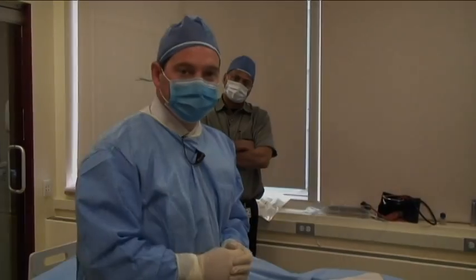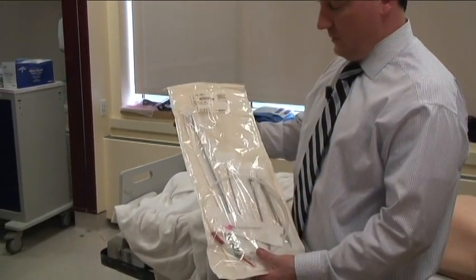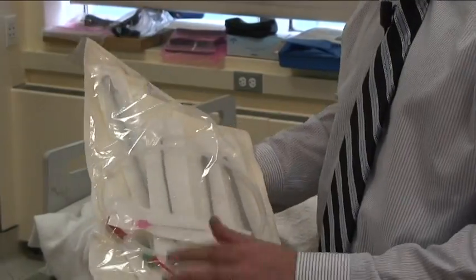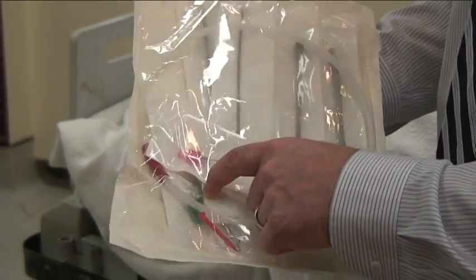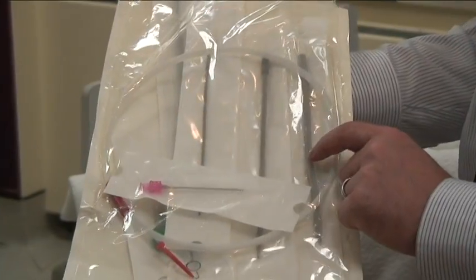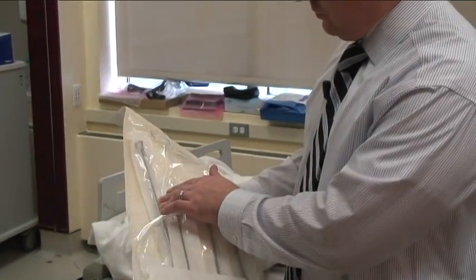Thank you very much. I also wanted to show that these kits come in different sizes. This one here is a 20 French kit, which is obviously bigger than the 14 French kit, but they make these up to a 28 French. All the difference is it's the same needle, guide wire, scalpel. It's just a successive dilator kit. So instead of just one dilator, it comes with a small, medium, and a large dilator. This helps for the larger tube because you need it to be a bit more dilated. And then you actually have the larger tube in here.